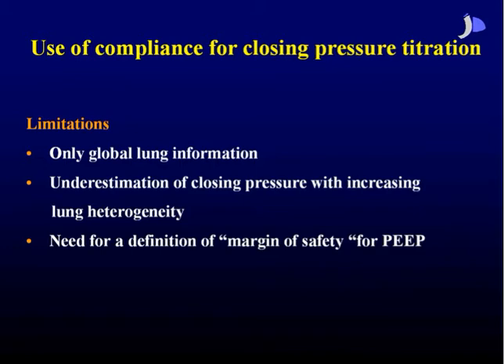Well, hemodynamics is always a consideration and is always a problem. But we are a little bit lucky when applying recruitment strategies, because the sicker lungs, which need the highest pressures, are the ones that are stiffer, and there's not a transmission to the pulmonary vasculature. So, in my experience, when you are at these high levels of pressure in these very sick lungs, your hemodynamics stays completely stable. When you are daring to recruit less sick lungs, then you can have problems. Your pressures are much lower, with 40 or 45 centimeters of water, which can cause a huge hemodynamic problem if you're not aware of volume status and cardiac function.